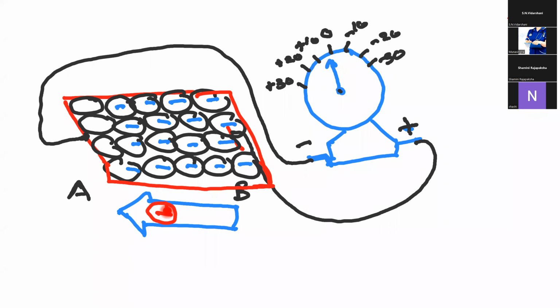If there is negative electric activity towards the negative electrode, the needle fluctuation will be positive. So this is the concept. You should know the concept 100%. I will explain this in a very easy manner in the next slide.